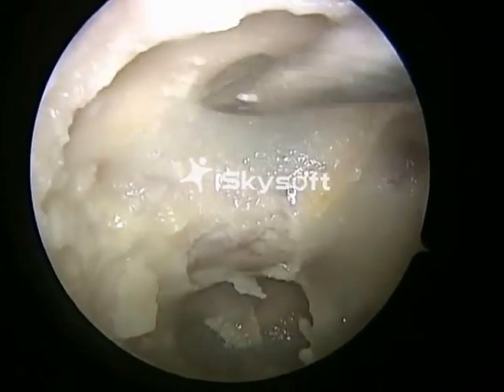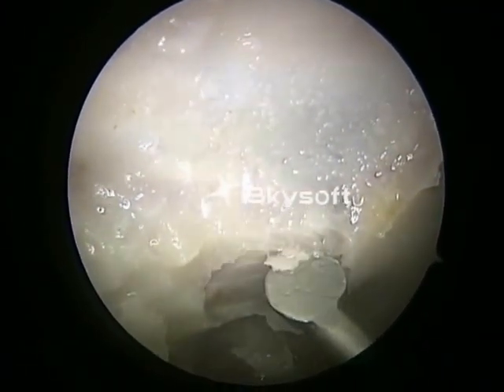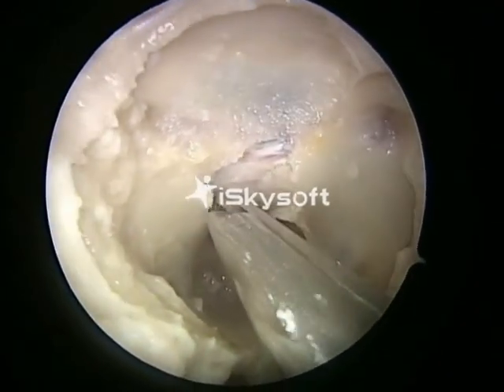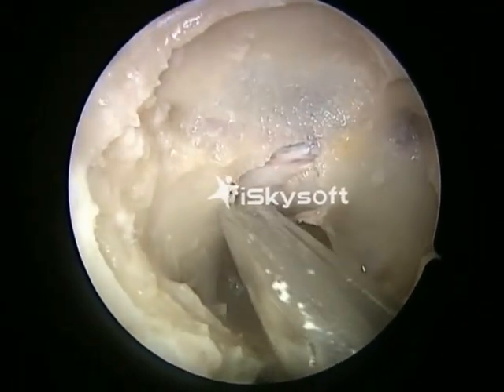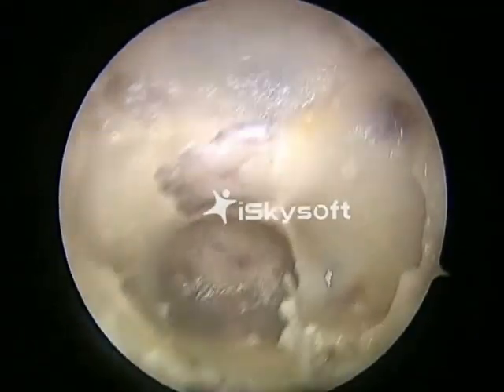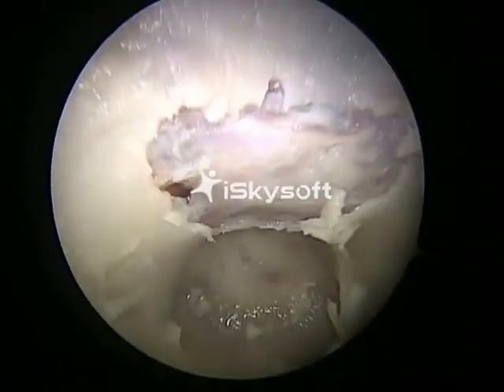and the limits of bone exposure in sellar dissection would be the 4 blues. Dura is exposed now. The limits of exposure would be superiorly the superior intercavernous sinus, inferiorly the inferior intercavernous sinus, on either side the cavernous sinus, and that is called the 4 blues.